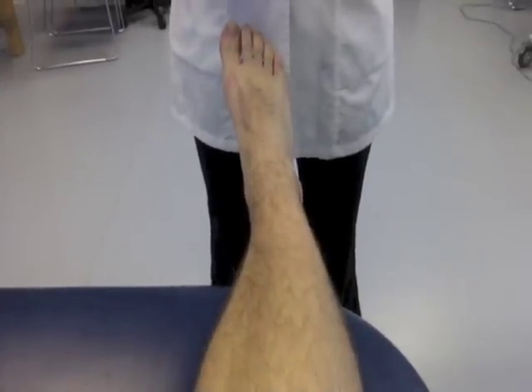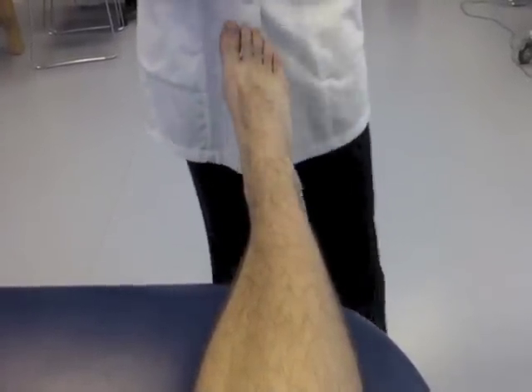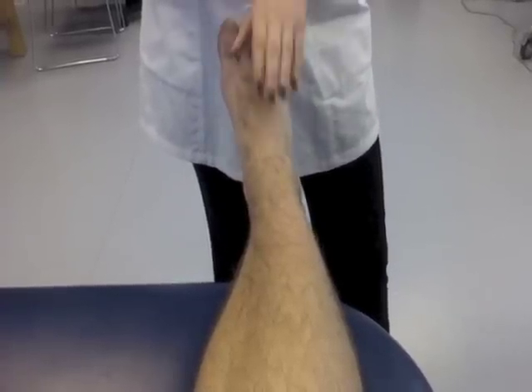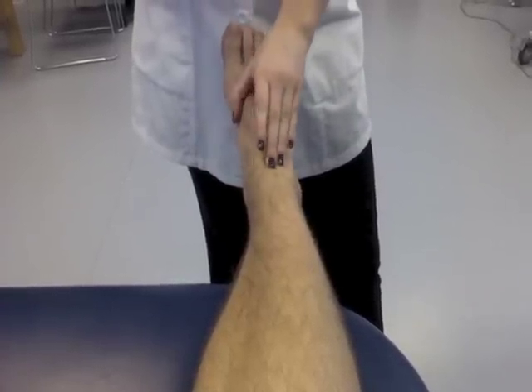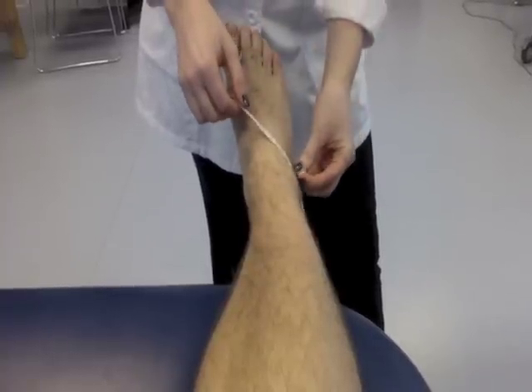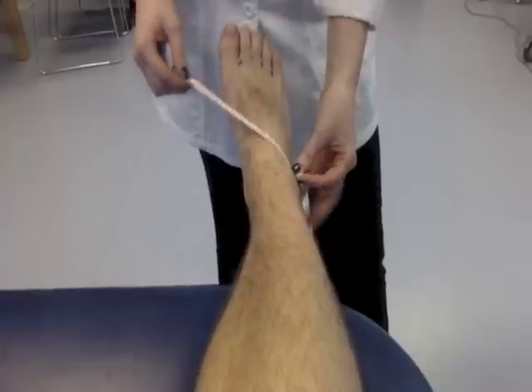To begin the test, have the patient lay on the table with the ankle maintained in a neutral position. To accurately perform the figure eight measurement, the PT will put the tape measure between the tibialis anterior tendon and the lateral malleolus. The tape is pulled medially and placed distal to the navicular tuberosity.